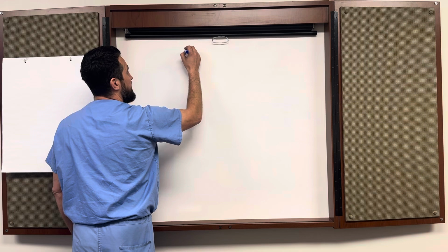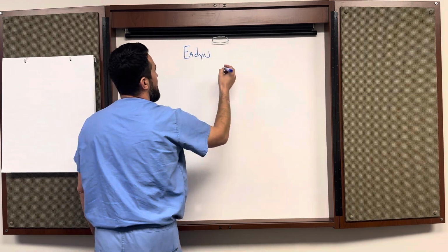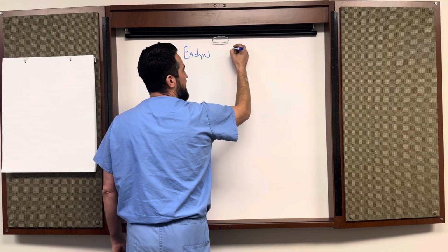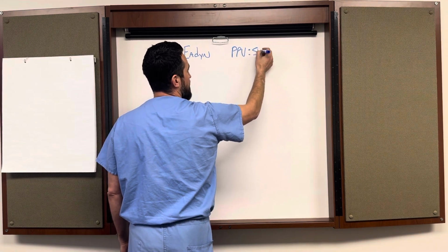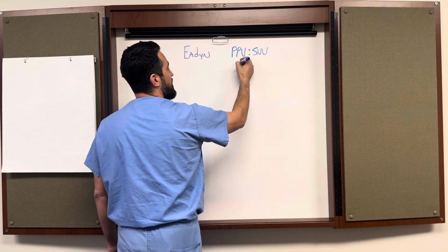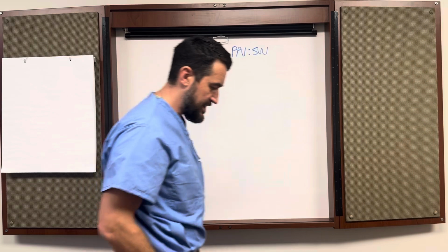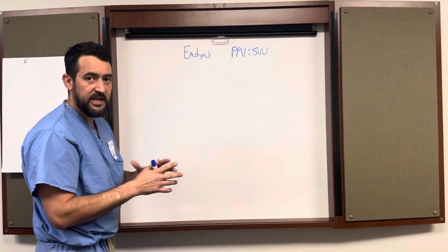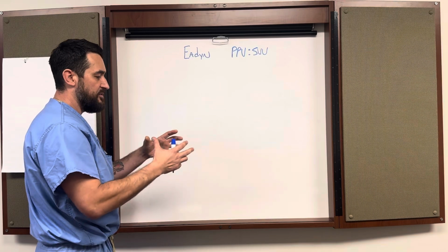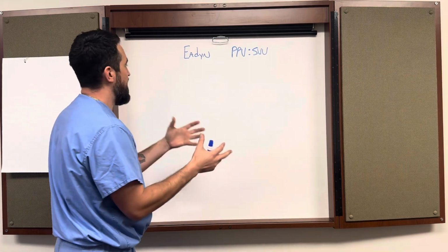Our last parameter that we're going to talk about is another afterload parameter, and it is called EA-dyne. The way that we find EA-dyne is pulse pressure variation to stroke volume variation, right? Again, pressure divided by flow to look at kind of a resistance type number. But what this relationship tells us about is what happens when the volume comes out of the heart and enters the vessels. How do they respond, right?